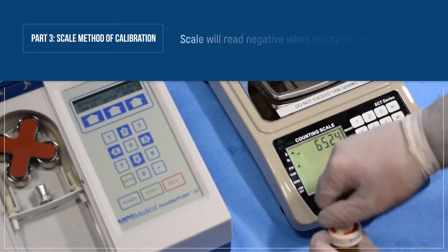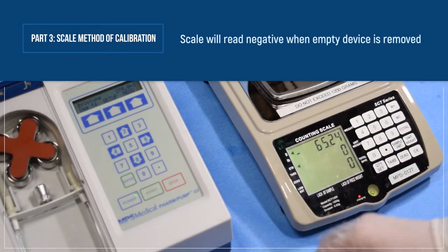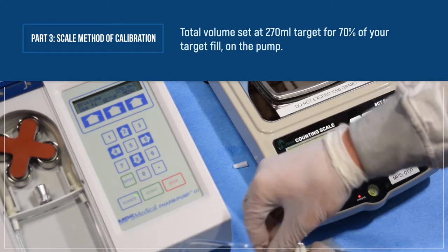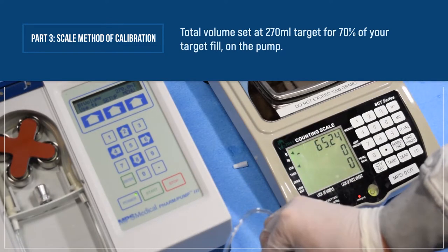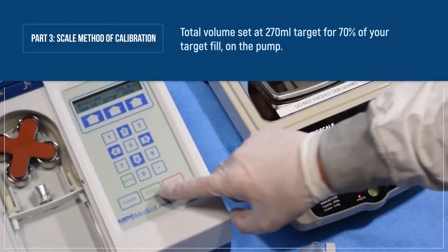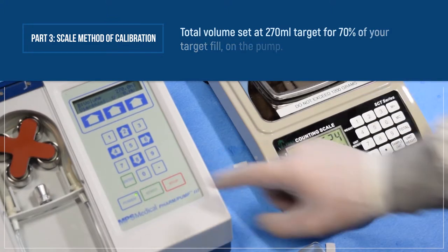In this example, we've set our pump to fill to 270 mLs. Your sample size should target for 70% of your total target fill. Connect the device and press start. Note the device is filling off-screen.